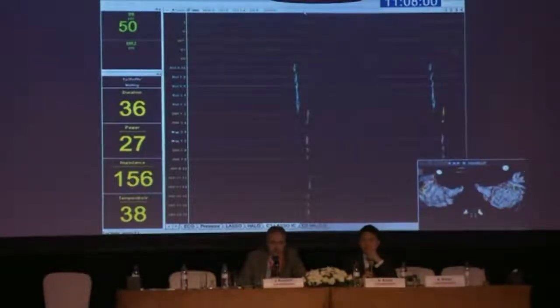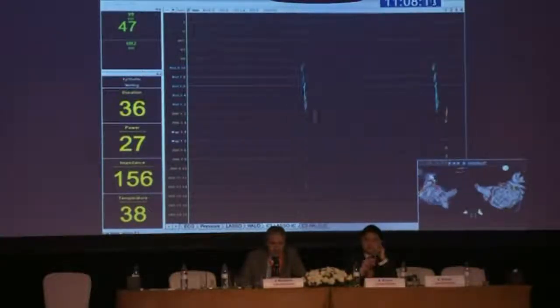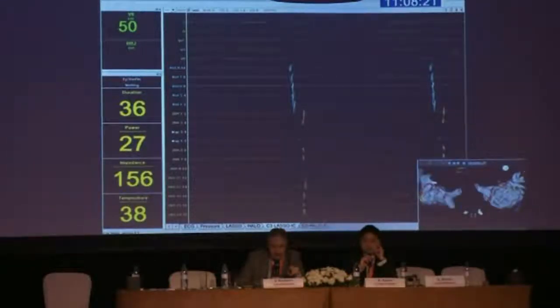And you can see as I come up the back wall here, the timing of the map appears to be getting relatively earlier. And that's clearly earlier than the left pulmonary vein signal. If you look at the signal now from the pulmonary vein and you see the ablation or mapping catheter, it's quite early now. Yeah. So that's a mapping of the gap of conduction within the vein.